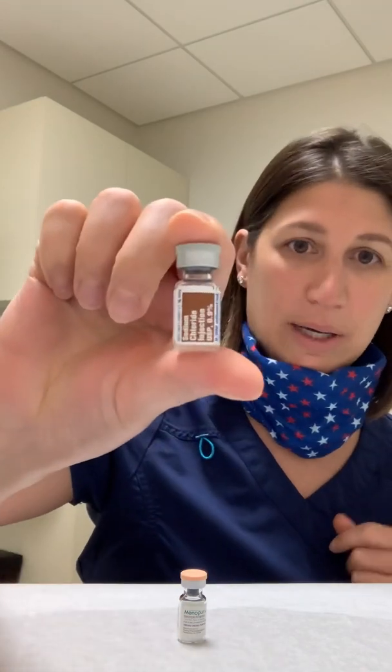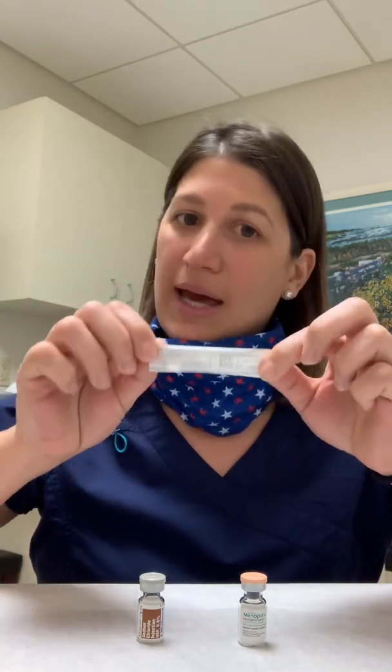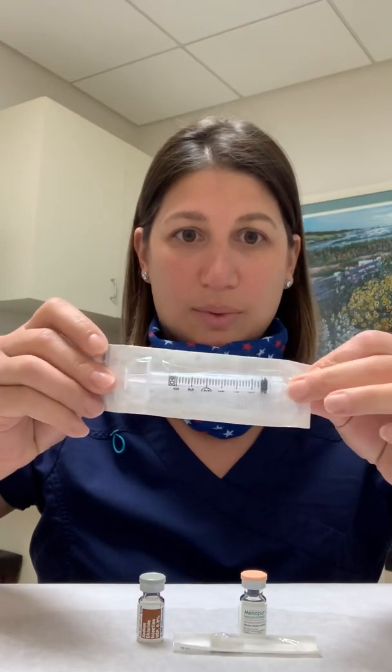If you're on one vial of Menopur, what you're going to have in front of you is the actual Menopur with the peach cap, a bottle of saline. In this bottle, there's two cc's of fluid — you're only going to be drawing out one unless we tell you otherwise, so there will always be leftover fluid. You do not need to save it, you can throw it right out. You will also have a 27-gauge half-inch needle, a 3cc syringe with no needle attached to it, and your Q-cap.